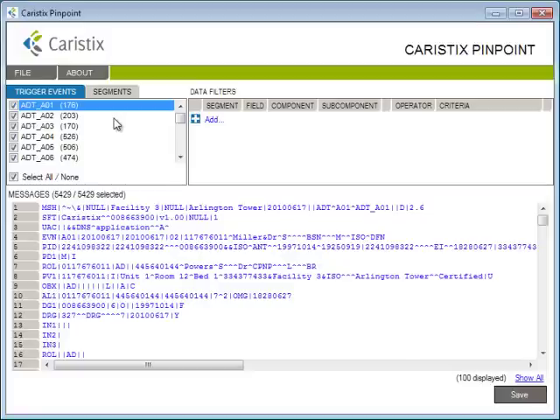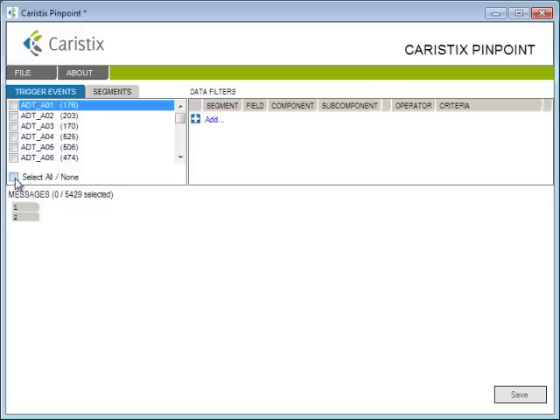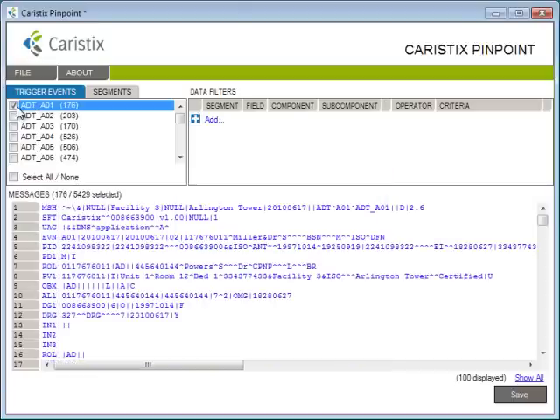Next, let's look at trigger events. In this case, we want to learn how this interface is handling patient admissions, so we'll go over to the Trigger Events tab. Click Select None to clear the checkboxes, then we select A01 to select for patient admissions. And that automatically filters out the other message types, and you're left with 176 messages to look through, rather than over 5,000.